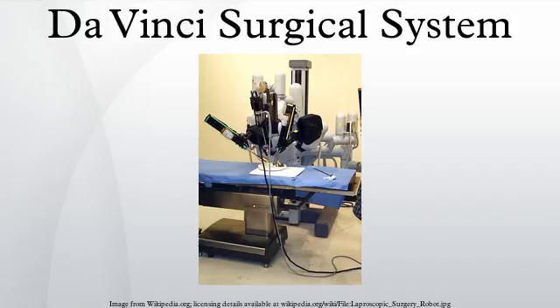In 2001, Dr. Marescaux and a team from IRCAD used a combination of high-speed fiber optic connection with an average delay of 155 milliseconds with advanced asynchronous transfer mode and a telemanipulator to successfully perform the first transatlantic surgical procedure, covering the distance between New York and Strasbourg. The event was considered a milestone of global telesurgery, and was dubbed Operation Lindbergh.